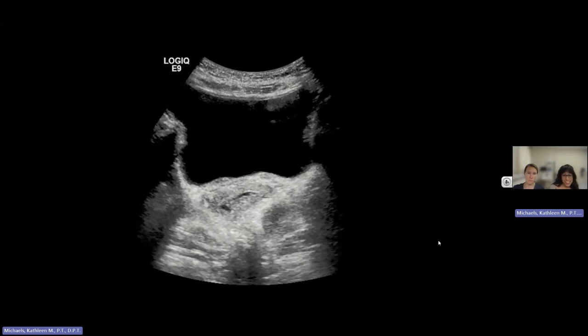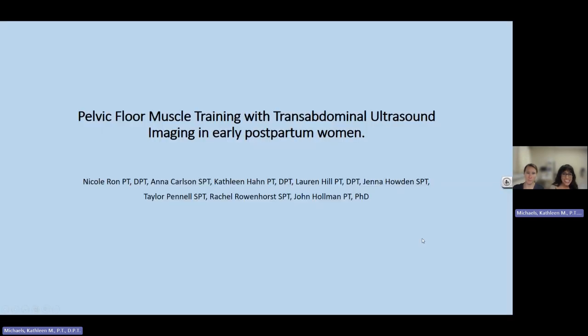We'll put our ideas about this in the discussion paper of our session, but we wanted to propose a question to listeners. In our study, 30.7% of participants demonstrated bladder base descent during their initial attempts at pelvic floor muscle contractions with verbal instruction alone. So we wonder if pelvic floor muscle contraction effort results in bladder descent rather than ascent in some women. Are we doing greater harm than good when we verbally and indiscriminately prescribe Kegels or pelvic floor muscle contractions in the early postpartum phase, which is the standard of care at most institutions?